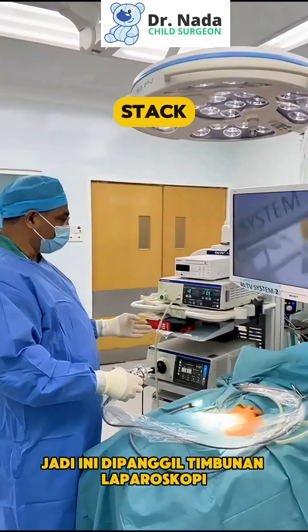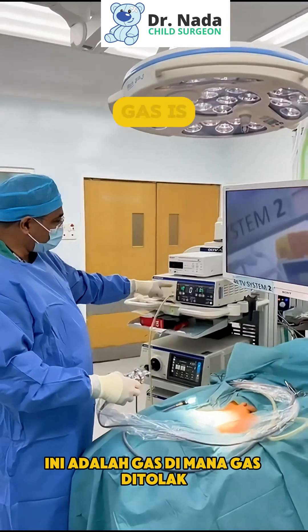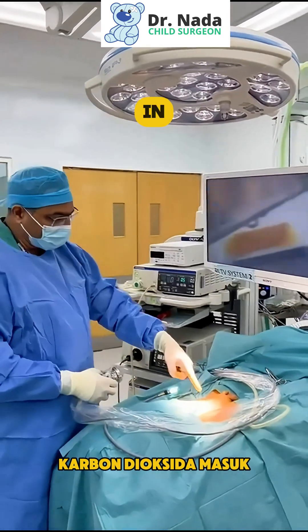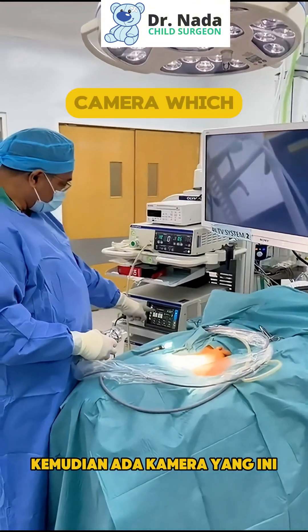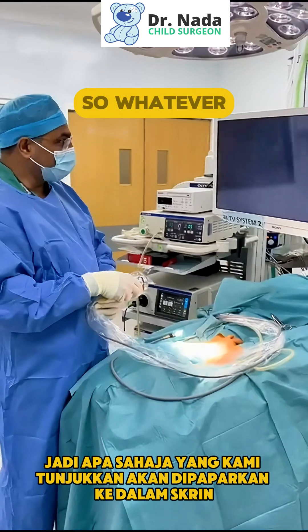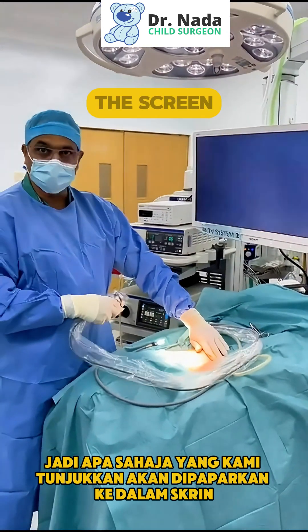This is called a laparoscopic stack. We've got different aspects of this. This is the gas — where gas is pushed, carbon dioxide is going in. We will inflate the tummy with carbon dioxide. Then there is a camera, which is this one. So whatever we show, it will show on the screen.